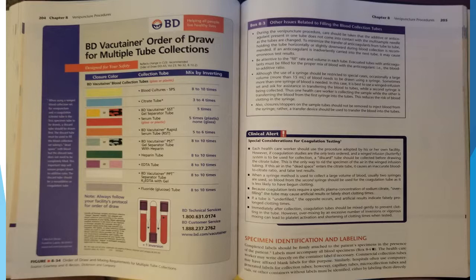Be attentive to the fill rate and the volume in each tube. Evacuated tubes with anticoagulants must be filled for the proper mix of blood with anticoagulant, that is, the blood to additive ratio. Although the use of a syringe should be restricted to special cases, occasionally a large volume, more than 15 milliliters of blood, needs to be drawn using a syringe. Sometimes more than one syringe of blood is needed. In this case, it is best to use a winged infusion set and ask for assistance transferring the blood to tubes while a second syringe is being collected.